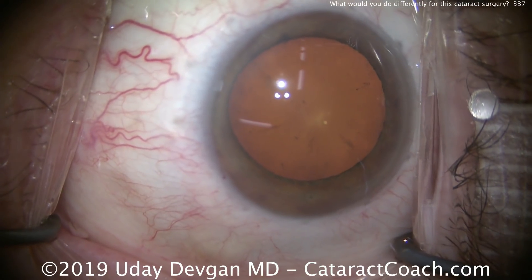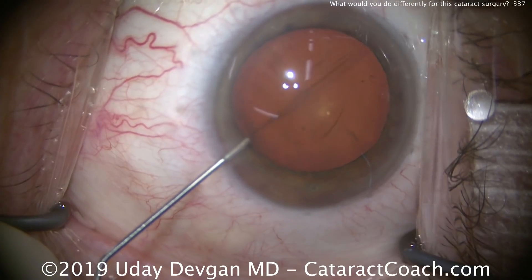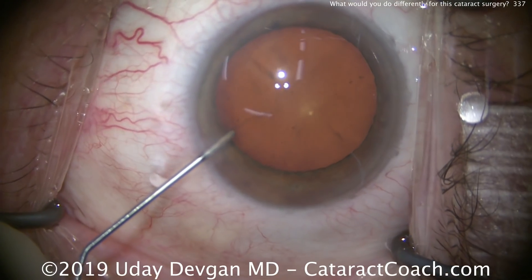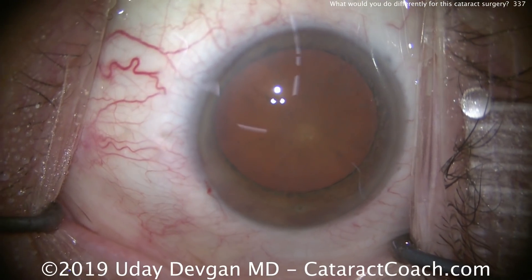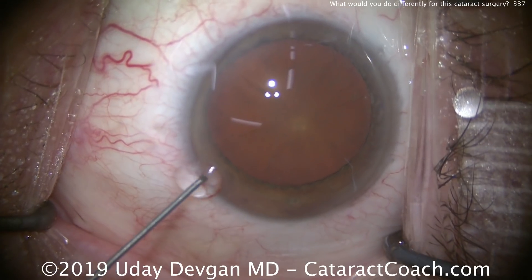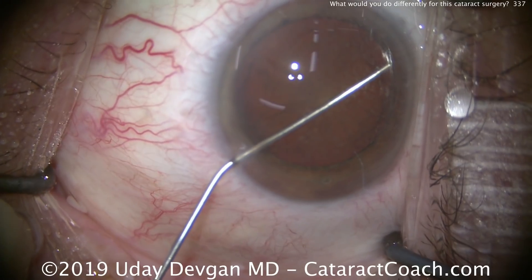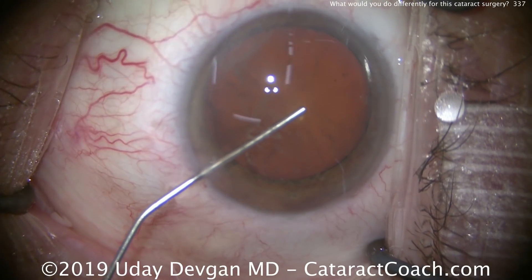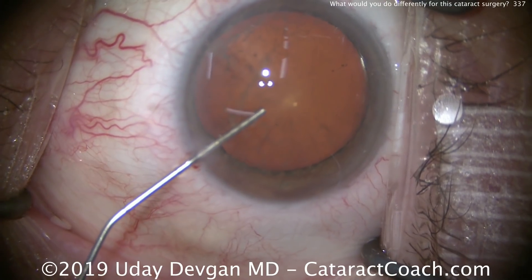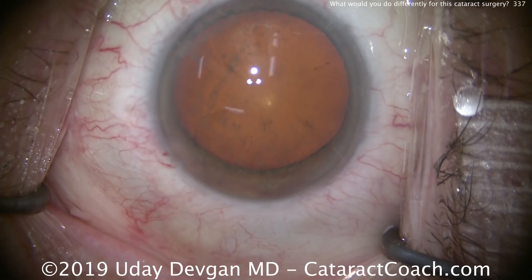After making the paracentesis, we're going to put our anesthetic inside the eye — preservative-free — and we put it with a little bit of an air bubble. You can see there are a lot of tiny little air bubbles along the endothelium now. Now we instill the dispersive viscoelastic. You can see a lot of those air bubbles being pushed around.